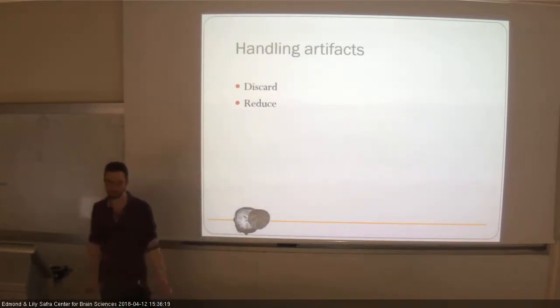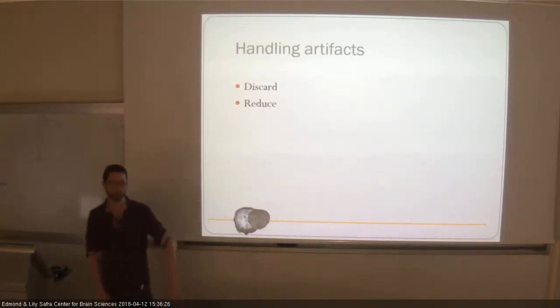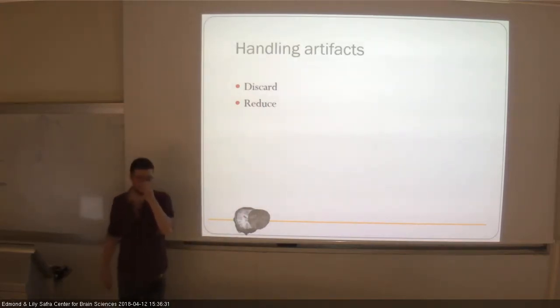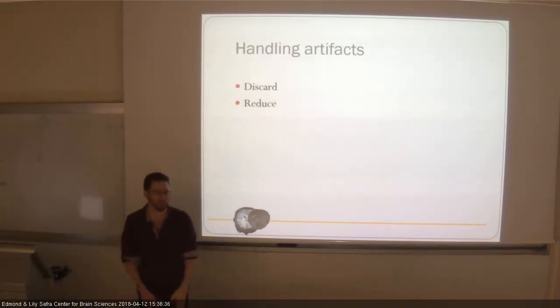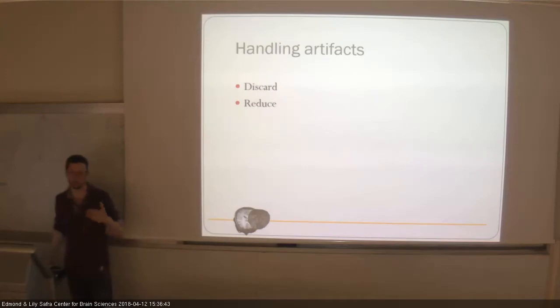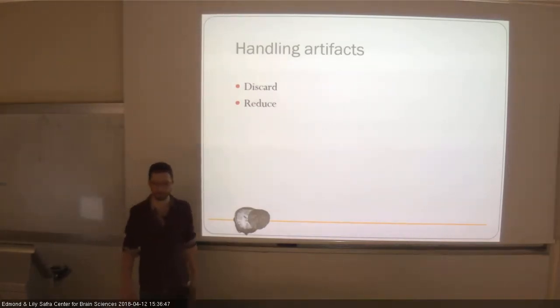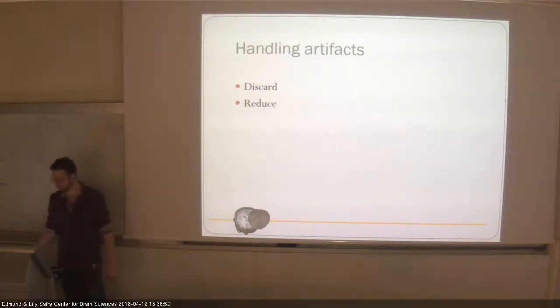This is usually done by taking your EEG recording and applying some kind of automatic threshold of amplitude or some other criteria for finding artifacts. Whenever you have an artifact falling within a trial, you throw away the trial. You always have to do that because some trials are always going to have very, very loud noise, like if the subject moved his nose or something. So this is pretty simple.